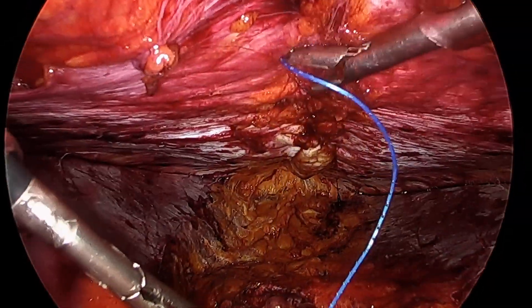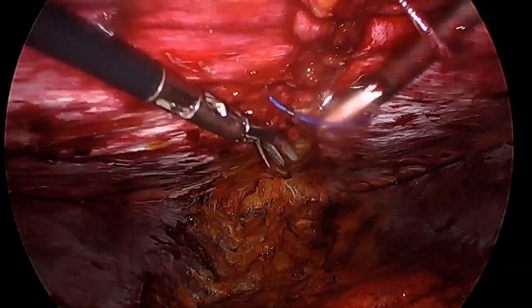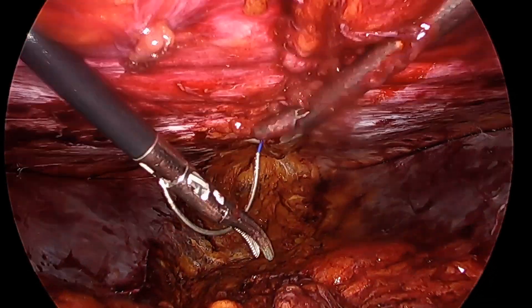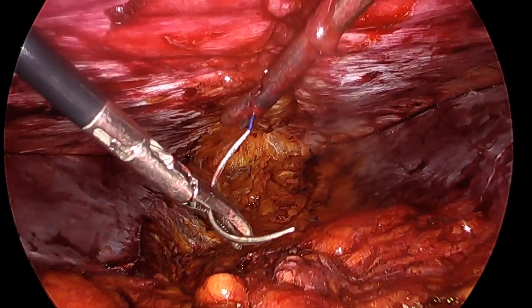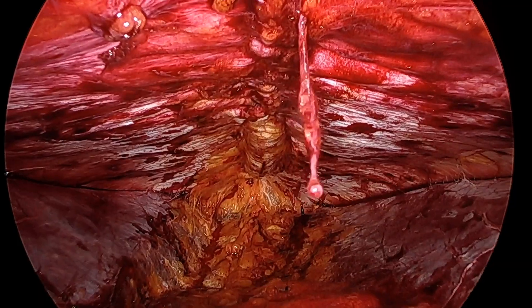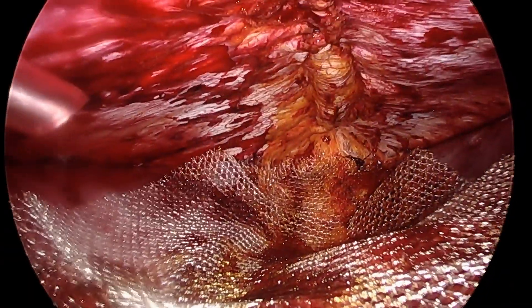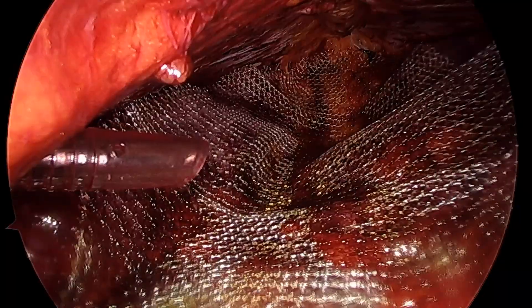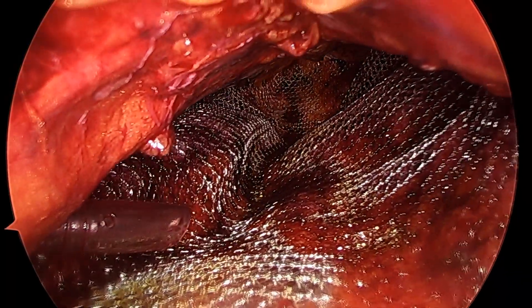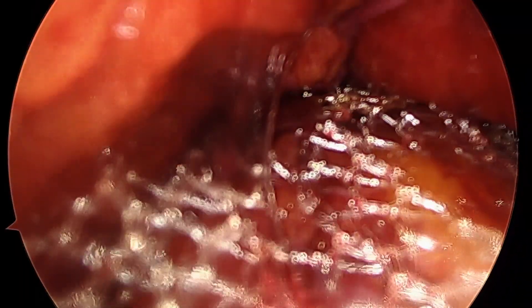Then I'm going to run the suture back through the line which I came from, just to reinforce a little more, and finally extract the needle out of the extraperitoneal cavity. You can see there the closure, and finally placing a heavyweight macroporous polypropylene mesh covering the space that we dissected, then removing the CO2 from the cavity, and that's it.